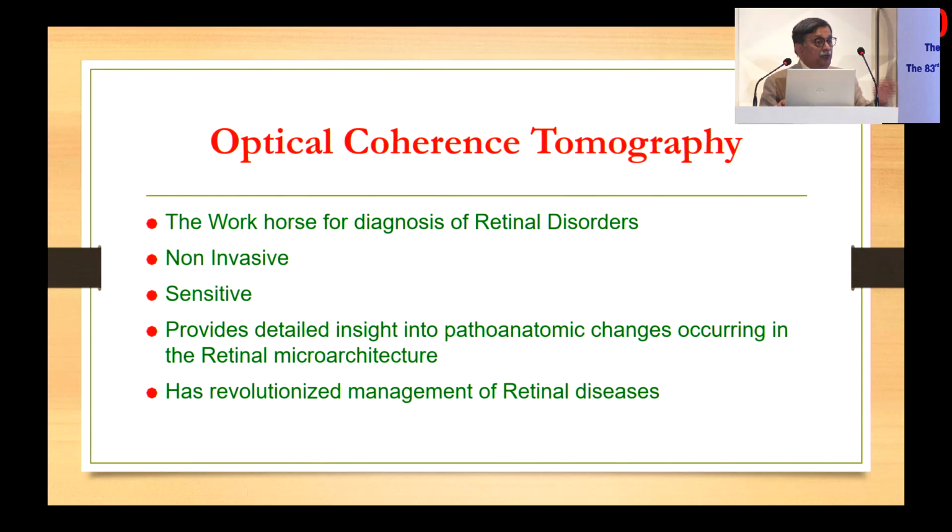So ladies and gentlemen, you can see there are lots of things to be discussed. You can ask whatever questions you want, but it's quite obvious to you that this is a workhorse for us for managing, diagnosing retinal disorders. It's non-invasive, it's sensitive, provides a detailed insight into the pathoanatomic changes, and has revolutionized the management of retinal diseases. Thank you.